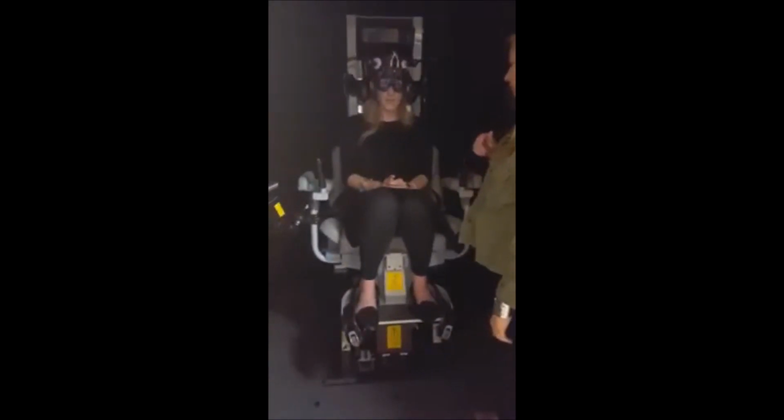Next, she'll place some holders over your head. These may look intimidating, but they're simply there to make sure your head is stable during the test, and you actually end up feeling more secure in the chair. Lastly, she will put a seatbelt on because the chair will be moving, and we don't want you running away. The audiologist is then going to shut the door, and the room you're in is going to become very dark. Don't worry, you're still in the exact same place.